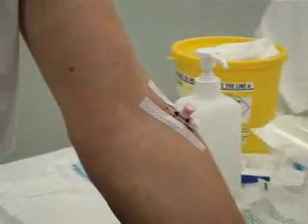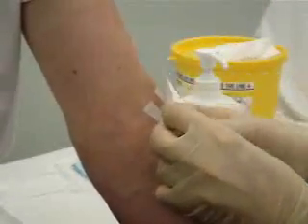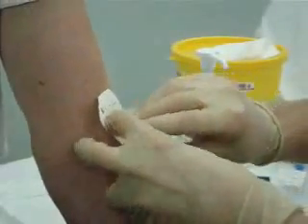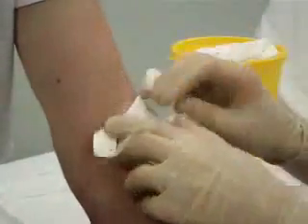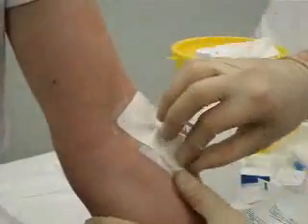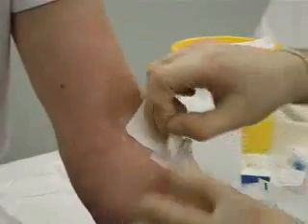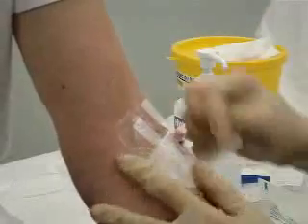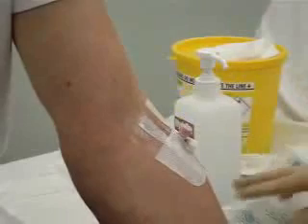Okay, and then the rest of it just goes over the top quite nicely. And then it gets stuck down, as so. And these are sterile dressings that can then be taken off nice and easily. There's also different ways to take them off, and each one has a slightly different method, so I'm just going to pull that off there. And as you can see now, the cannula is in position quite nicely.